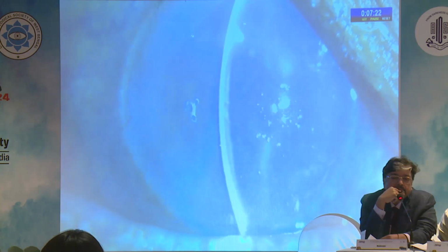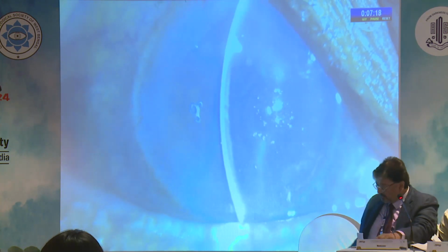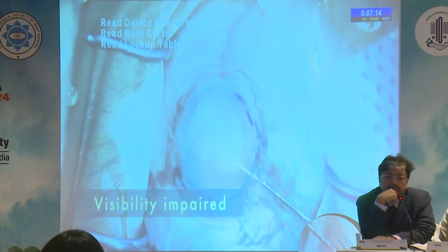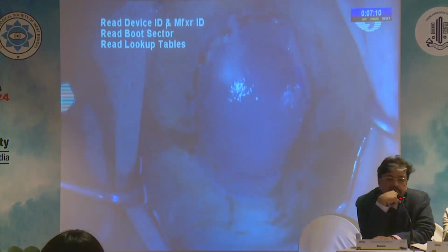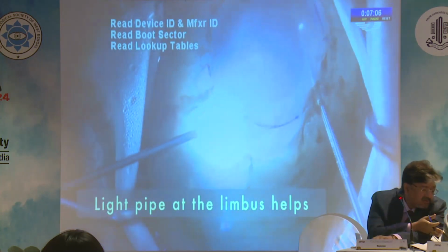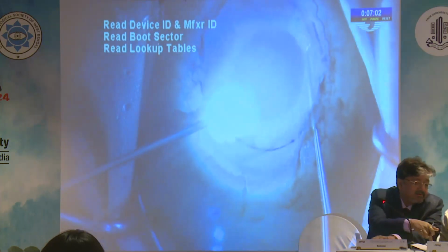This case is that of a cornea with advanced pseudophakic bullous keratopathy and corneal scarring. Visualization is extremely challenging and scoring the Descemet's membrane can't be completed. In this situation, using a light pipe at the limbus while switching off the microscope light helps improve visualization.